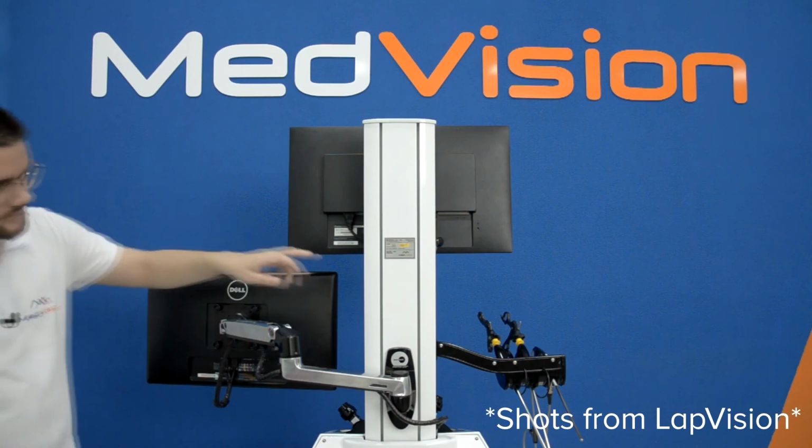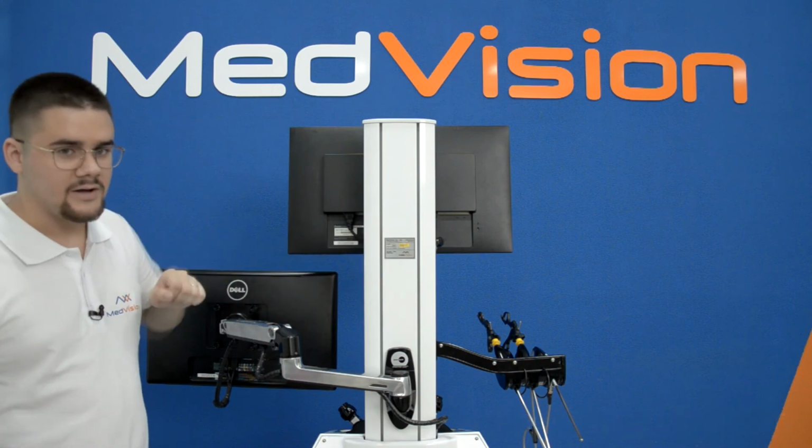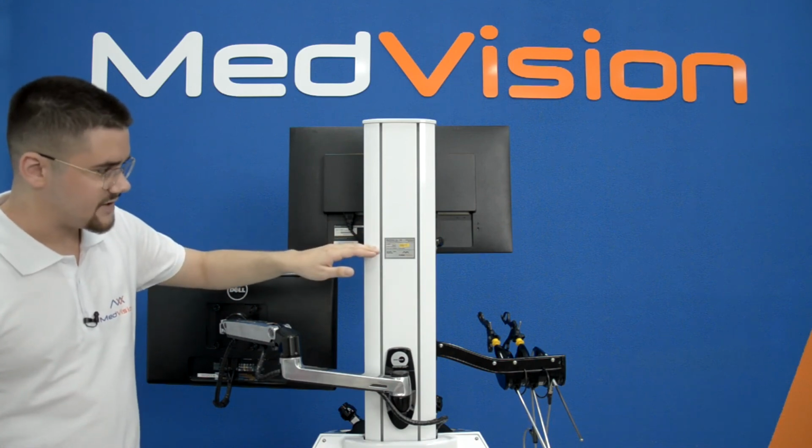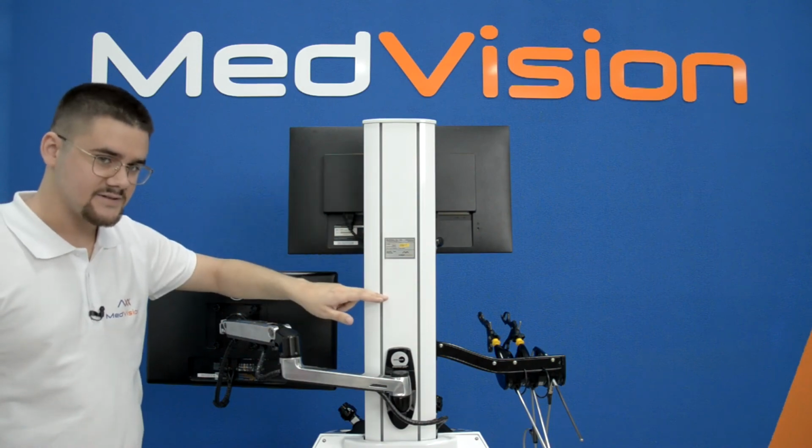And the plaque we have over here will specify your serial number, your Windows serial number, date of manufacture, and where it was manufactured. So it's always located at the back of this stand here.